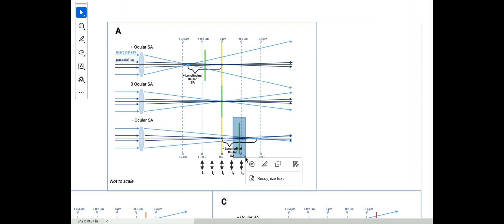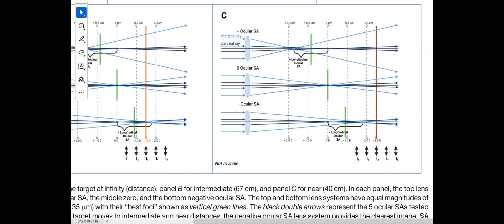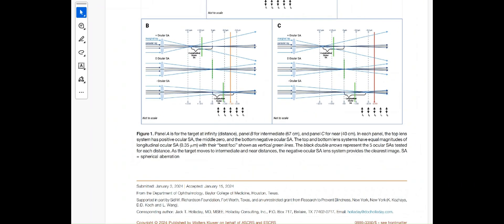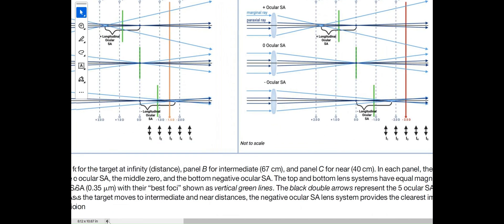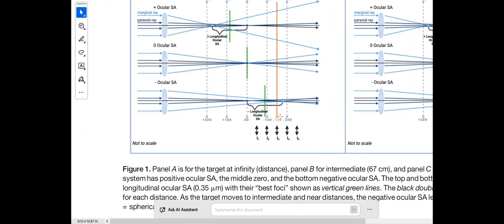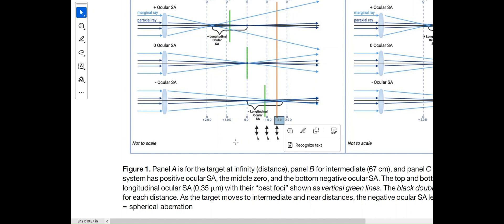Now let's see what happens when an object comes closer to the eye — at an intermediate distance. At minus 1.5 diopters, that corresponds to a distance of 66 centimeters. With an eye that has a positive spherical aberration lens, the best focus — the green line — doesn't shift. But when you have the target at an intermediate distance of around 66 centimeters, the blur circle is quite large.